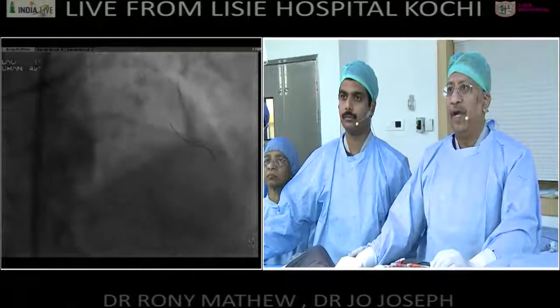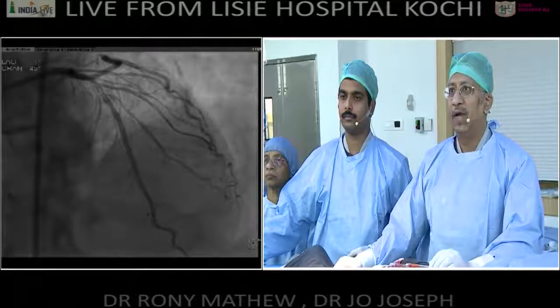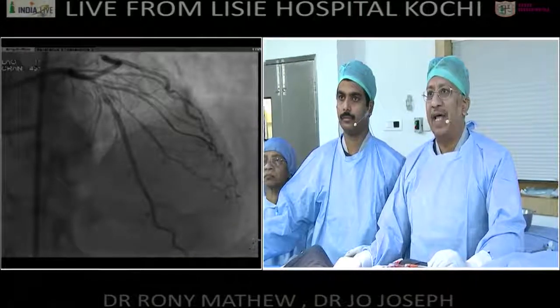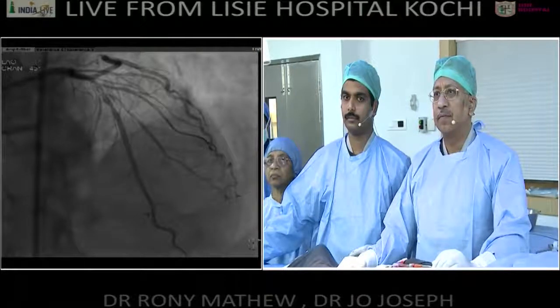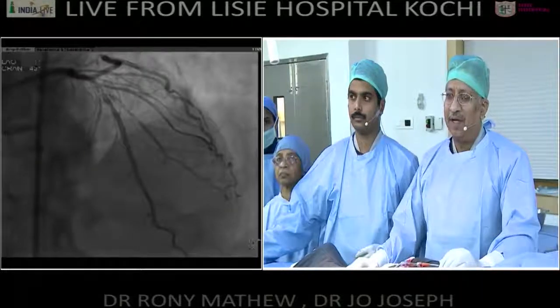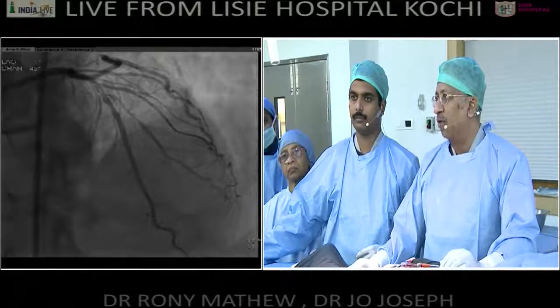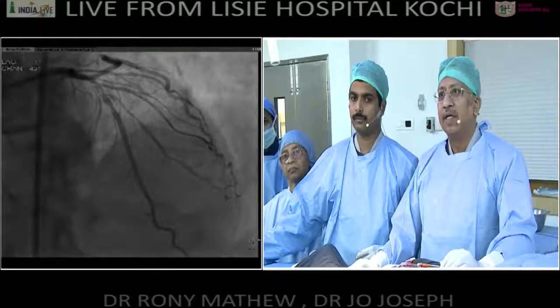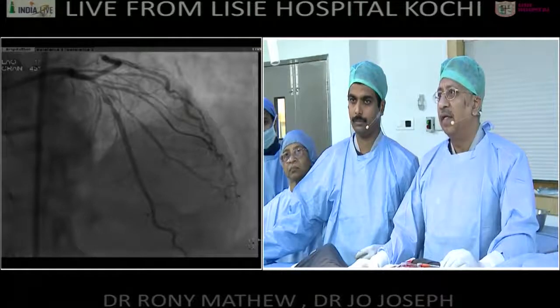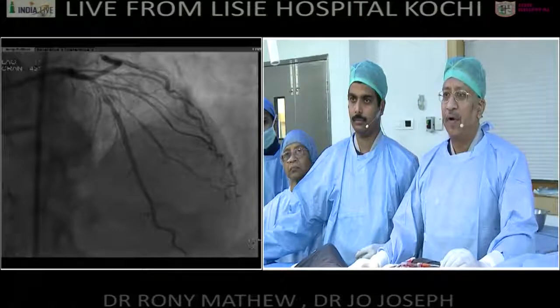Now you see we have a small dissection at the LAD, and we have a diagonal that's coming off from the dissected point. Of course, I don't want to discuss with you the strategies of stenting, but we decided that we're going to go with a 2-stent strategy over here, because the diagonal is big, there is a lesion in the proximal aspect of the diagonal, and the diagonal is at least 2.5 millimeters. So we thought we were going to go with a 2-stent strategy.